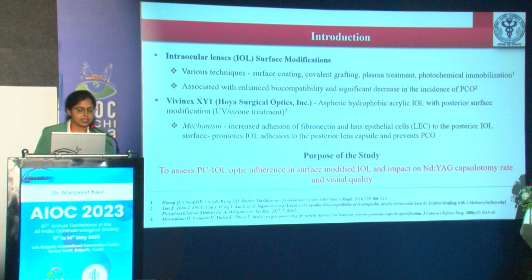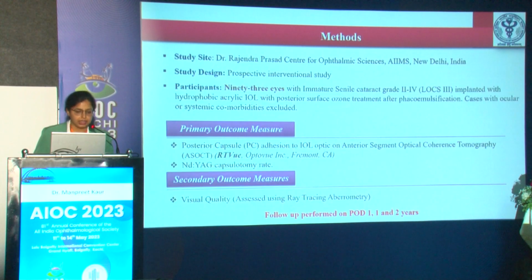So the purpose of the study was to assess the PC to IOL optic adherence in surface modified IOLs and its impact on ND-YAG capsulotomy rate and visual quality. Thus, it was a prospective interventional study performed at Dr. Rajendra Prasad Center for Ophthalmic Sciences, AIIMS, New Delhi.